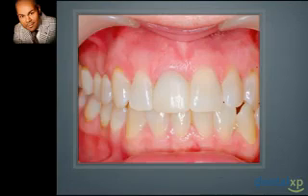However, I still noticed a slight depression at the free gingival keratinized margin, and with that in mind, I set out to, in addition to the socket seal technique described by Dr. Landsberg, see if I could increase the thickness of that keratinized tissue, maintain that, and prevent further resorption and or bring that more coronally. So today my presentation involves a series of modifications of different grafting techniques that I use to maintain this area.